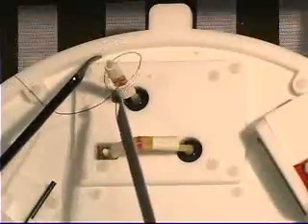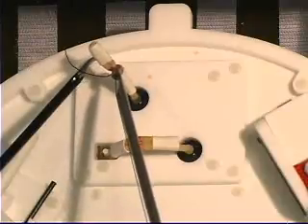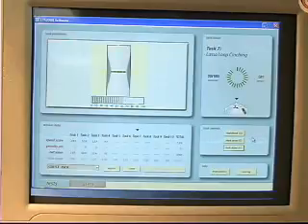The task is considered complete when the desired tension is maintained in the tube for a total of 3 seconds. A penalty score of 50 points is assigned for cinching the loop outside of the pre-marked area. A score of 0 is assigned if the tension is not maintained for 3 seconds. The cutoff time for this task is 180 seconds.